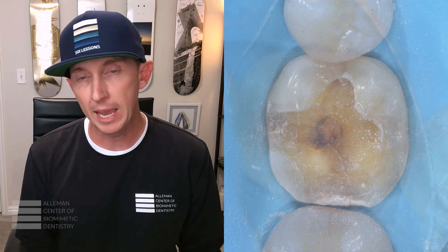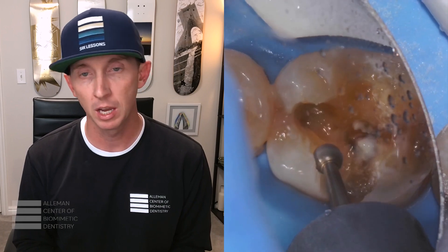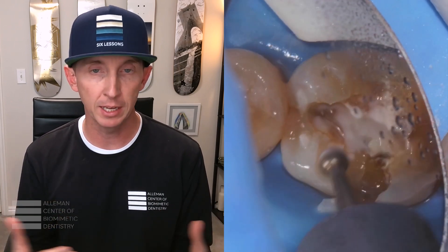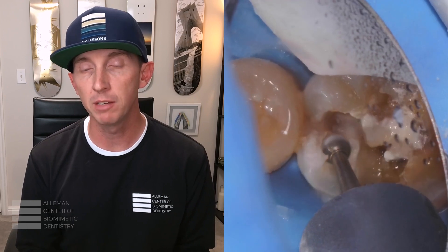In order to aid my visibility, I onlaid more cusps to ensure that when I do remove the fracture, I get and obtain a crack-free peripheral seal. We always want this to be free of any decay or any fractures. So when we do a deep margin elevation and seal the tooth and rebuild the bottom portion, we then connect the tooth front to back, side to side, and eventually top to bottom when we place our enamel replacement.